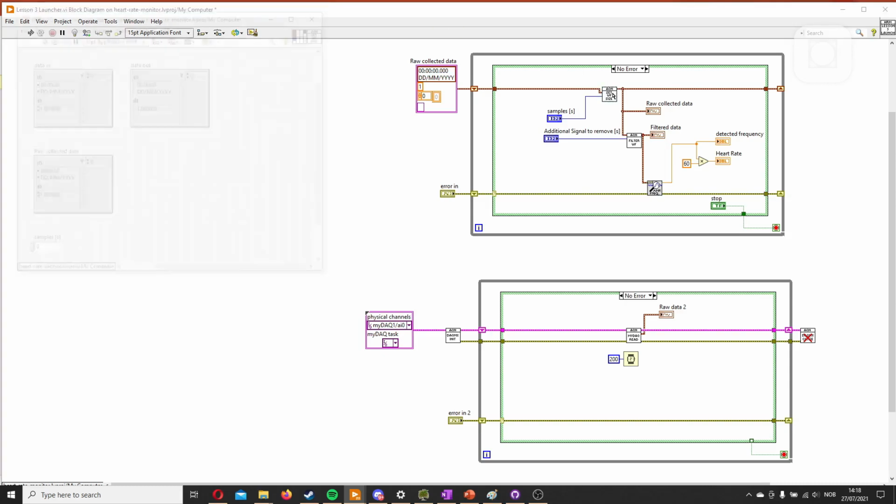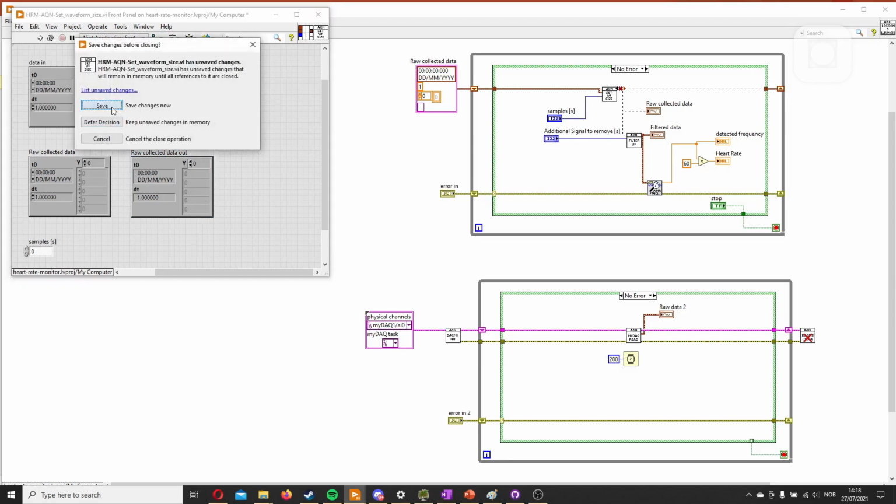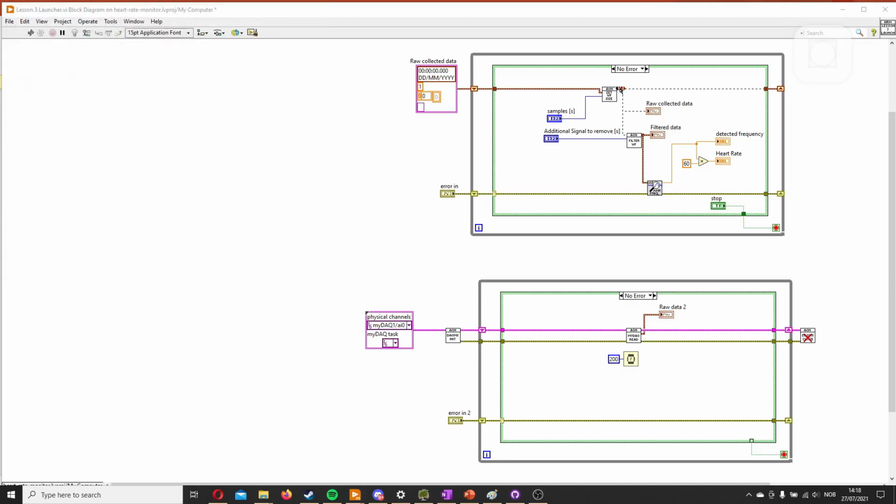So what we'll start by doing is actually move this one, disconnect the terminal, take it there, and then rename it to raw collected data out. And then we'll also move it just to indicate this. So now it will be much more obvious for you later, because I'd already forgotten and connected this wrong.